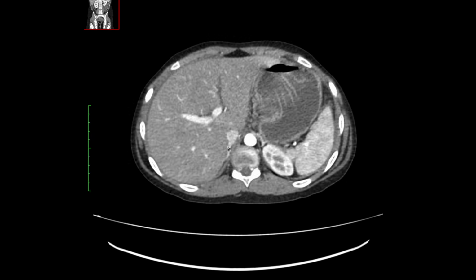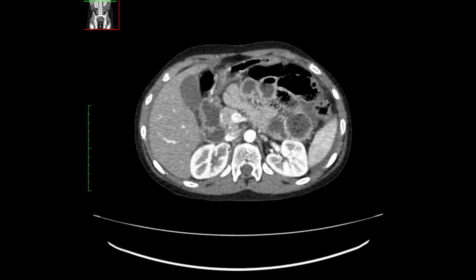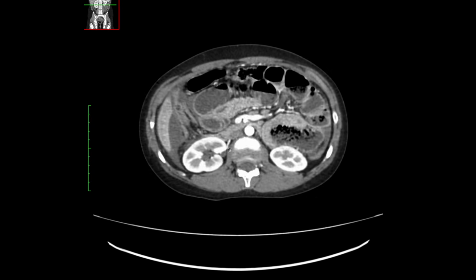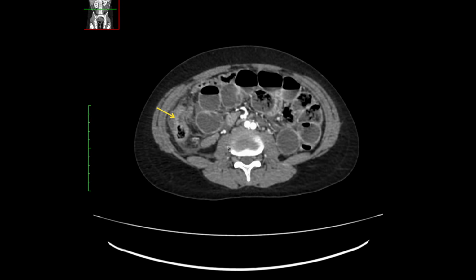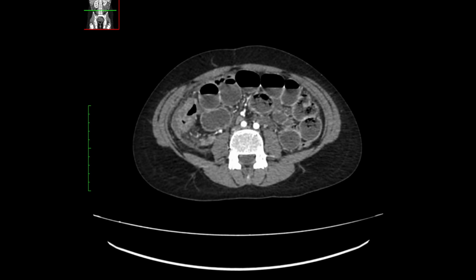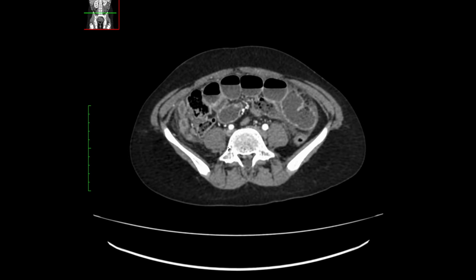This is the video of laparoscopic appendicectomy in perforated appendicitis with generalized peritonitis. The patient is in the pediatric age group, I think around 15 years of age, and I took him as an emergency surgery. A CT was done, and it shows a collection in the right iliac fossa.